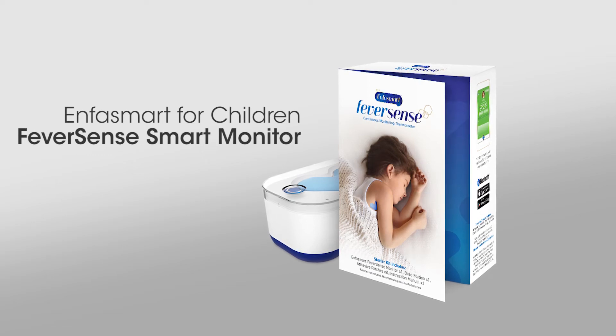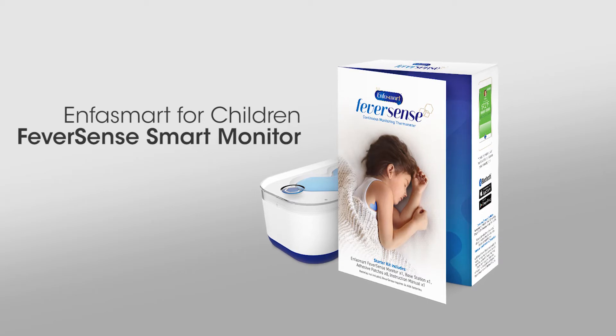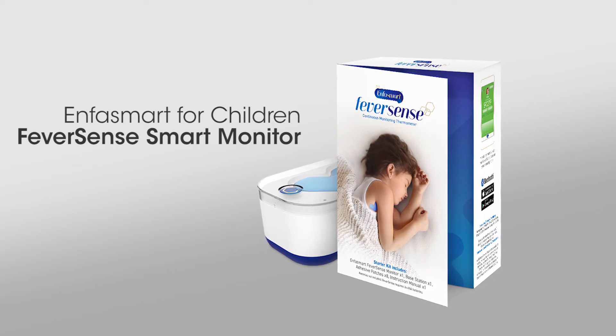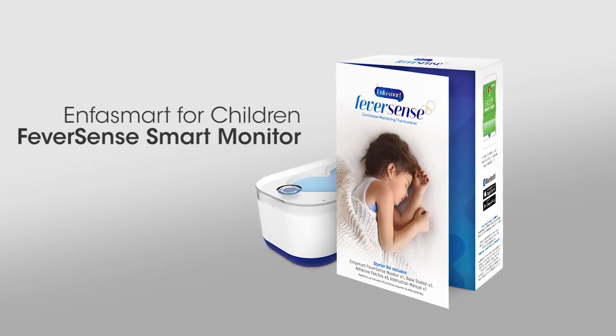Introducing FeverSense, the Smart Temperature Monitor — our pioneering new product so you can feel in control of monitoring your child's fever. It means you can accurately monitor your child's temperature without disturbing their rest.